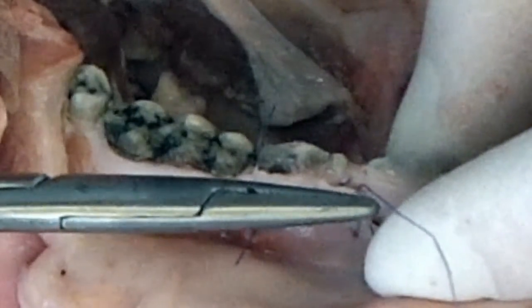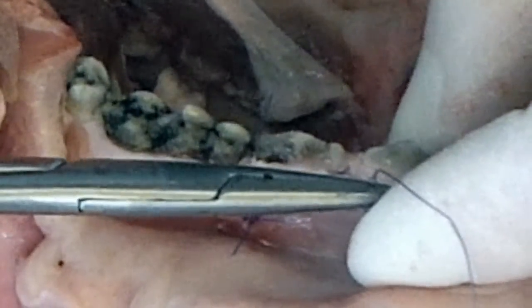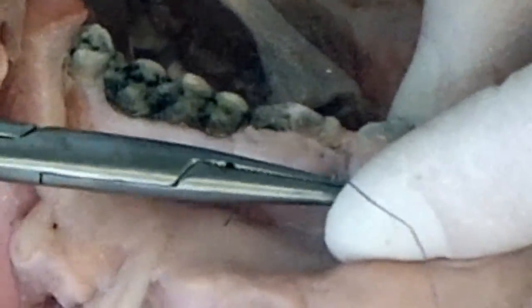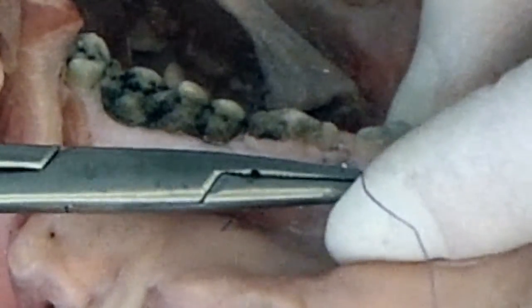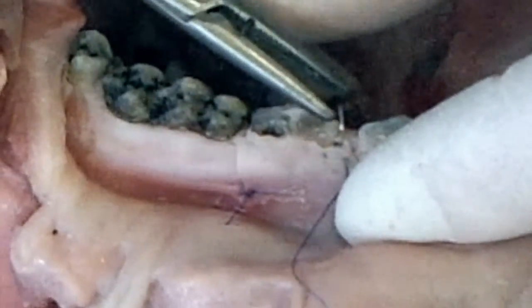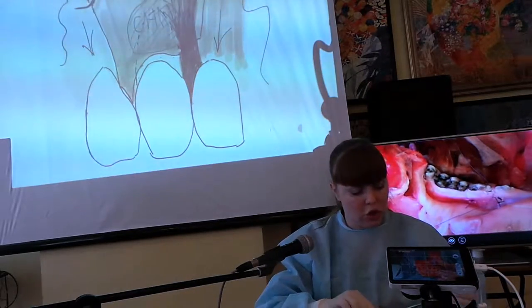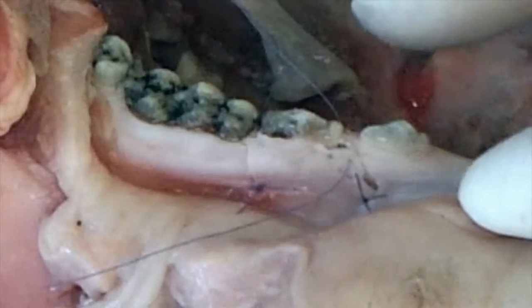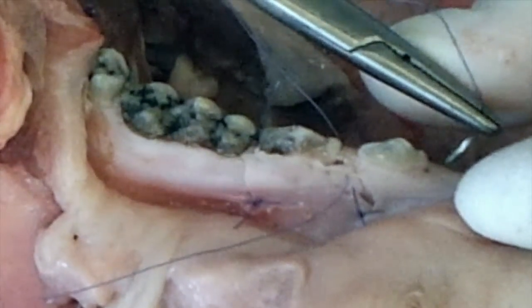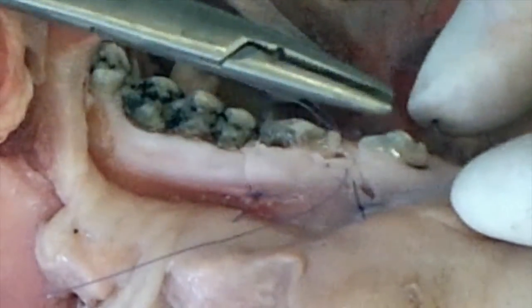Вы проводите вкол вестибулярно, начиная от подвижного слизисто-надкостничного лоскута, пронизывая насквозь анатомический сосочек деэпителизированный. Выкол проводится на нёбной поверхности. Обвиваете с нёбной поверхности шейку зуба. Делая вкол углы в нёбный межзубной сосочек, выходите в зоне деэпителизированного анатомического сосочка.